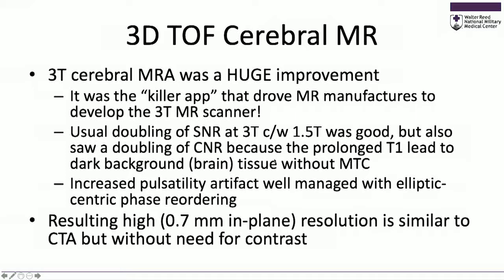Pulsatility artifact, of course, is more difficult at 3T. There are a number of ways to manage this, including elliptocentric reordering. And our in-plane resolution is equivalent to that of CT.